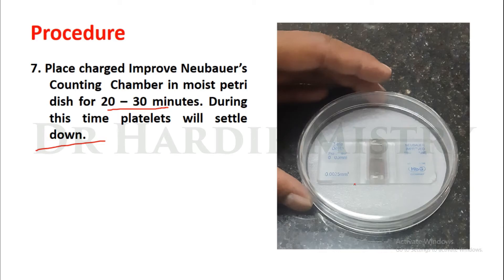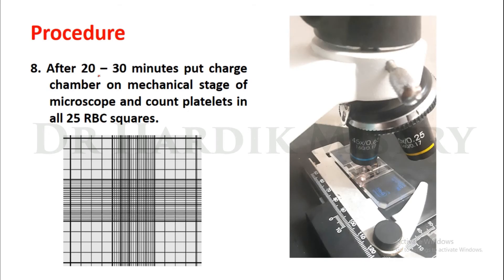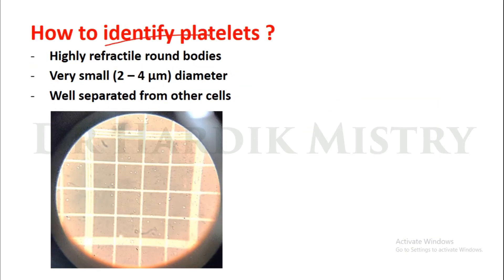Wait for 20 to 30 minutes because during this time platelets will settle down. After 20 to 30 minutes, put the charged chamber on the mechanical stage of the microscope and count platelets in 25 RBC squares. The center square is the RBC counting area, and in that area there are 25 squares where you count platelets using the 45x high power lens.